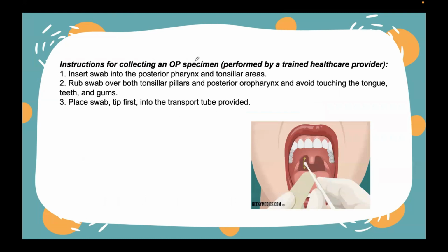Next, instructions for collecting your oropharyngeal. Dapat po widely open yung mouth ni patient and then yung insert mo yung swab doon sa posterior pharynx and tonsillar areas. Doon po, kasi tonsils to, diba? Ayan, dito mo po siya sa swab, hindi dito. Hindi sa alveolar, hindi.